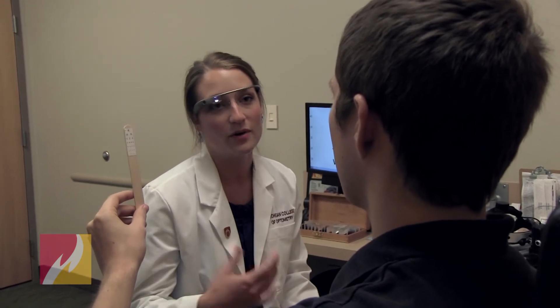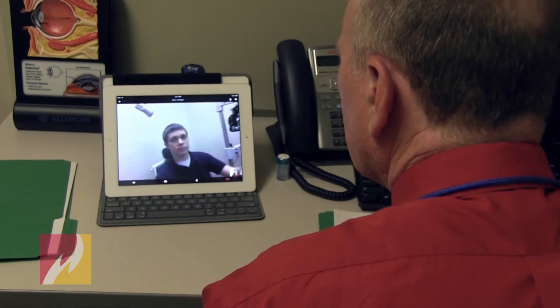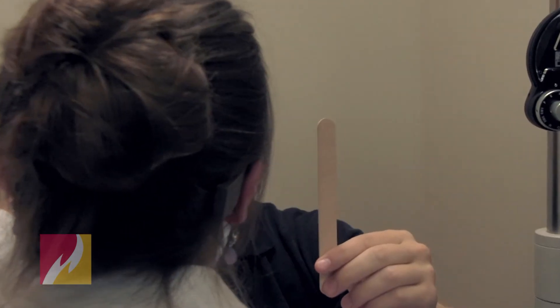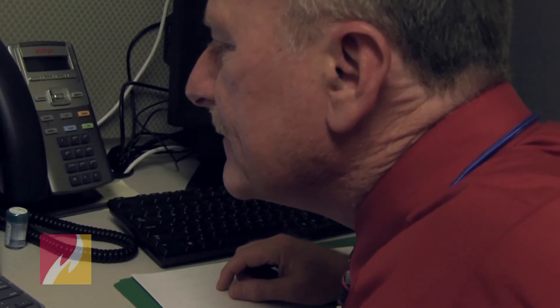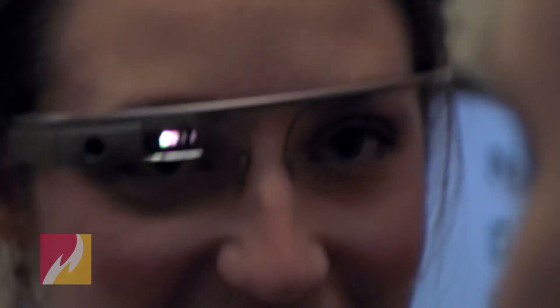Paul, we're going to do a test that goes over how well your eyes focus together on a target. Focus on that popsicle stick. I'm going to give my instructor a call — I do have a question. Call Dr. Morgan. Hey Dr. Morgan, I have a few questions. I'm going to go over a cover test with the patient — I need to isolate an ESO deviation. Is it base in or base out? That would be base out. Still seeing some movement, so I'm going to put 10 in front. I would agree. That looks much better. I agree. Thank you, Dr. Morgan, I'll talk to you later.